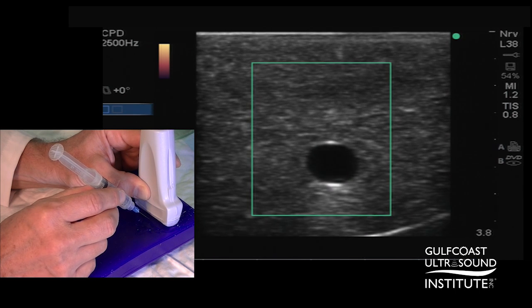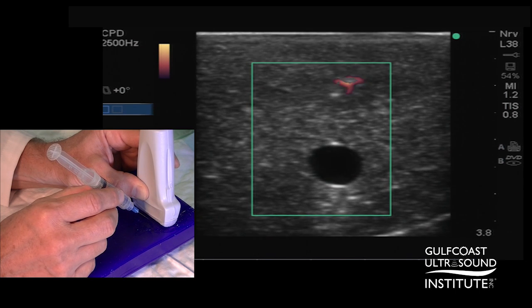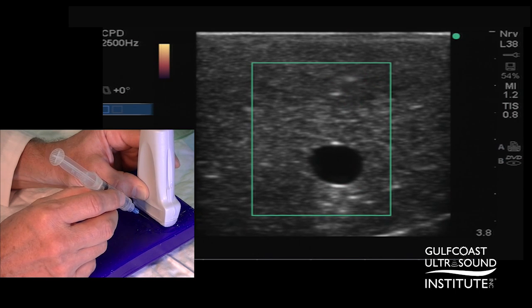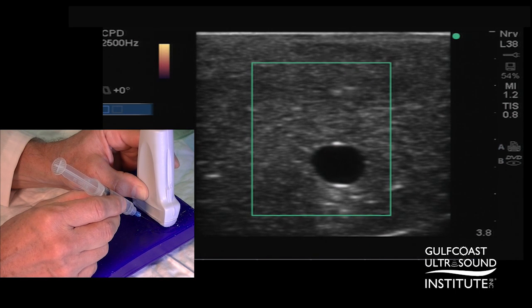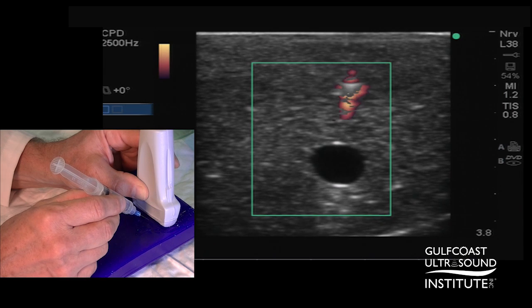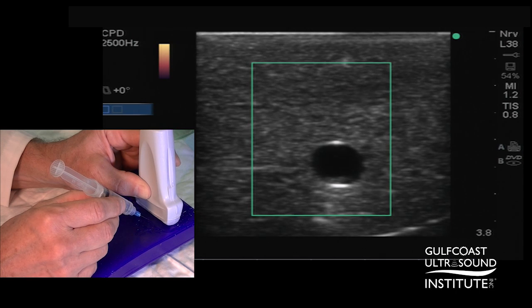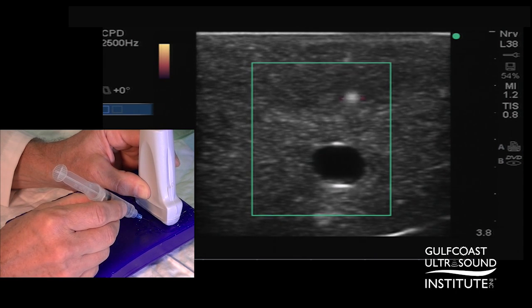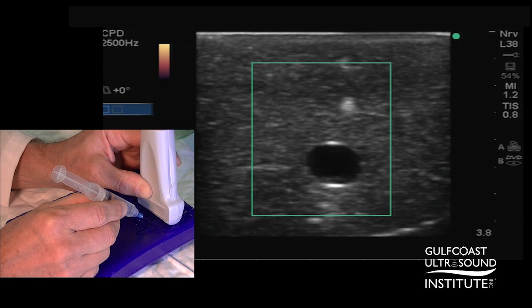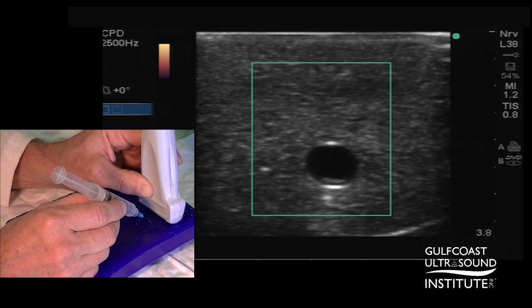As you fan away, moving the needle, we're not seeing the flash as we fan towards it — we can see the tip of the needle. So if I now advance by poking and I want to find the needle tip, I agitate the needle and slide or fan away until the power color signal disappears. Advance again, slide away, agitate the needle until the power signal disappears.